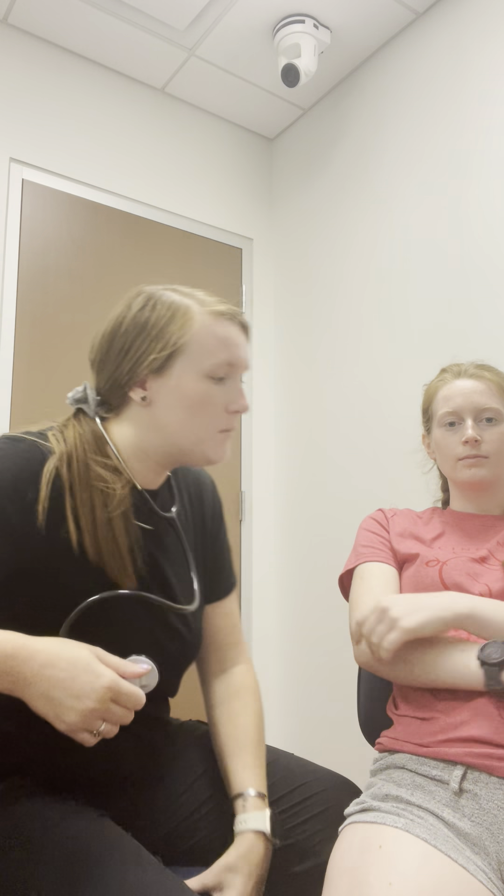Moving on, we're gonna do the heart. It's important to be on the right side of the patient, and you want them to be almost at a 45-degree angle, so kind of sitting back a little bit. You're gonna start — there's gonna be four spots.